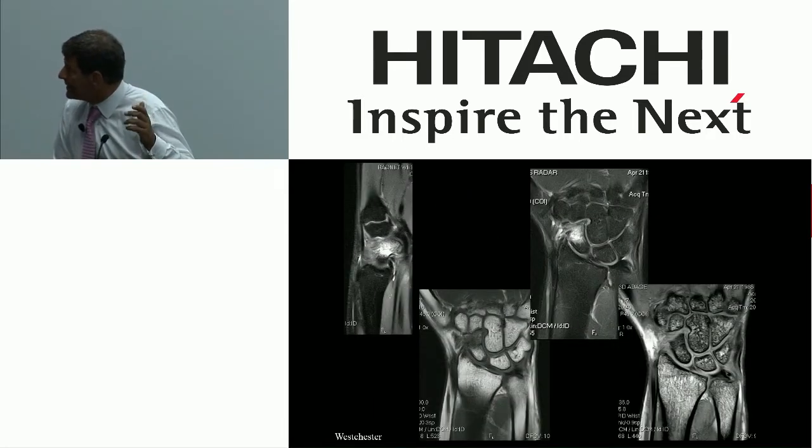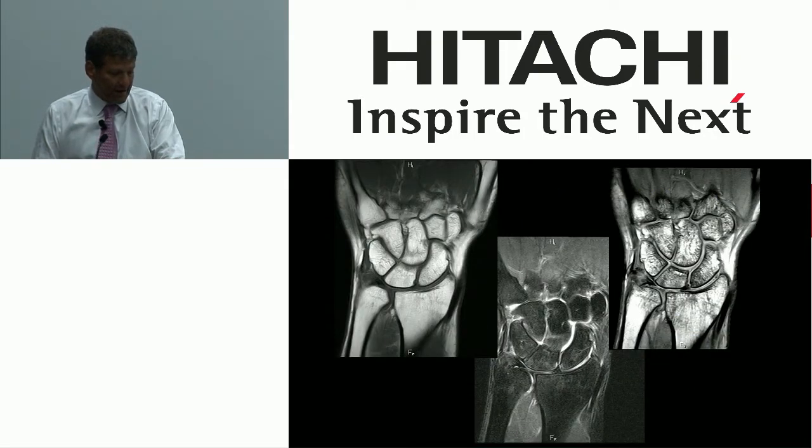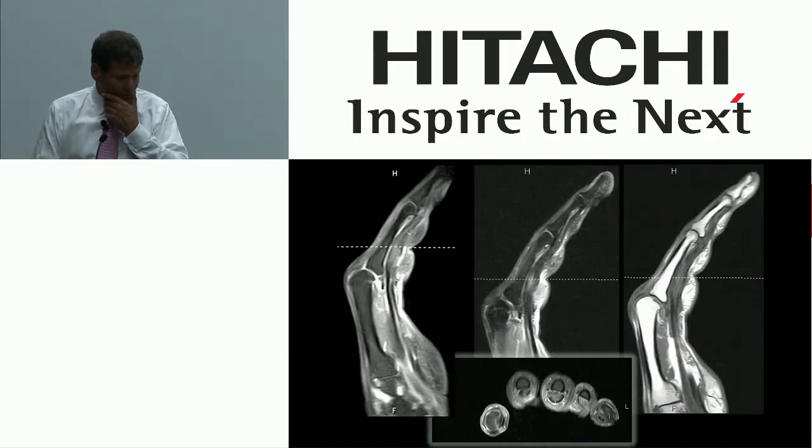Here again, you can see the typically really robust fat suppression we're getting on the system with excellent coils. And really, I think it's not so much the field strength as it is some of the technical optimizations that we can get to get better and better fat suppression and make it more consistent across the board.